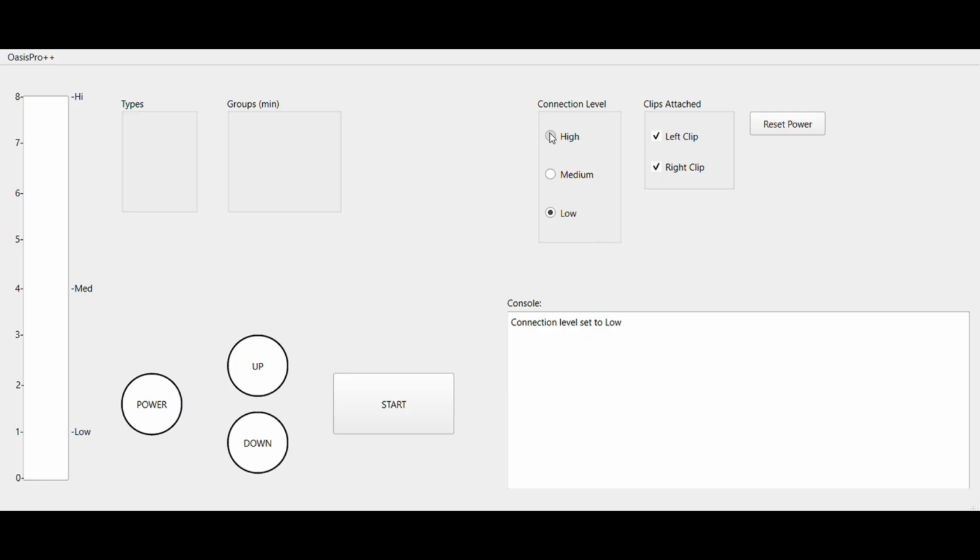So this simulates it. Same thing if like an ear clip detached, like the left one, what would happen if the left one fell off? What should happen in the software? And then if you resume the session, how should that work? This is to simulate that. This one is just to reset the battery level. So like if you're to change the batteries, get it back up to 100%. The console displays various things, just information to show you what would happen, make sure everything's working correctly.